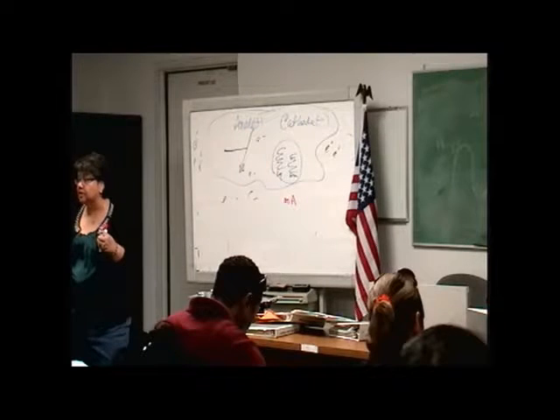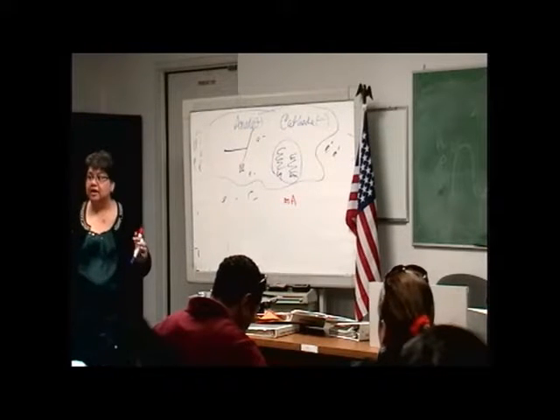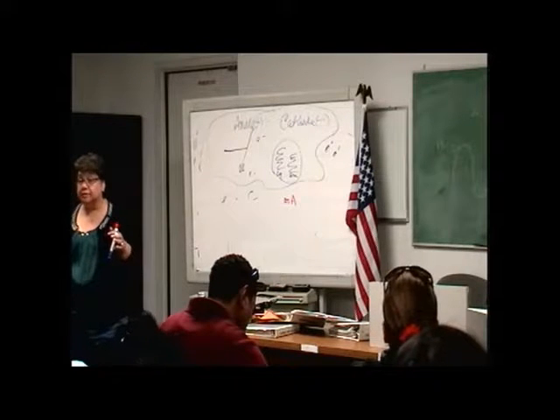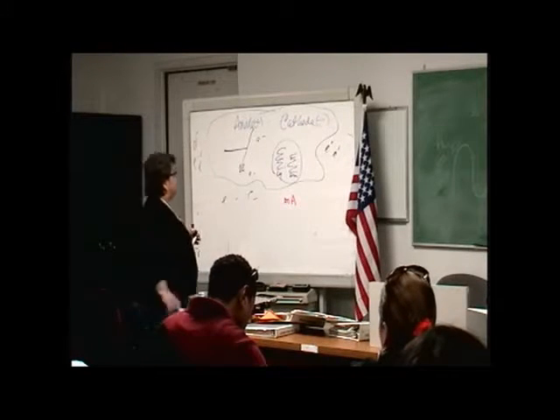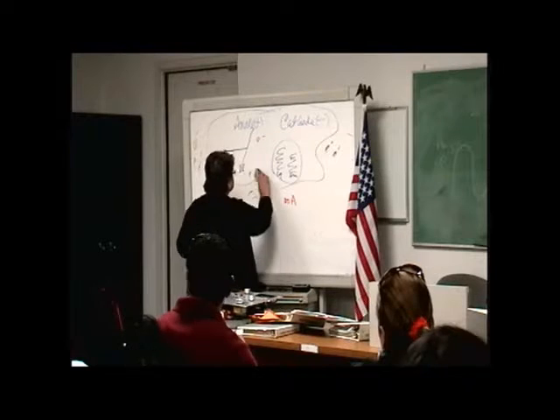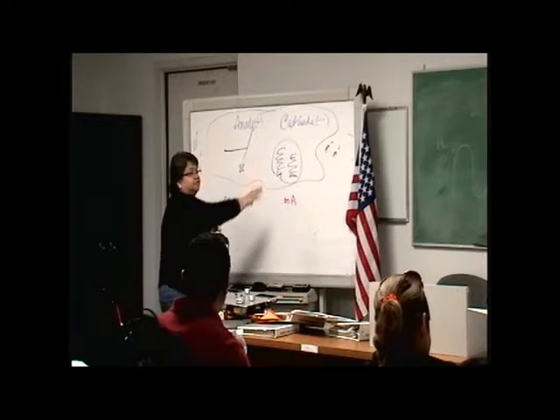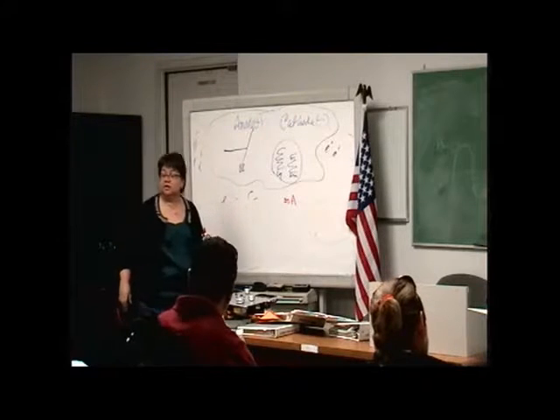We're being very selective. I only want so many electrons, and I want them as controlled as much as possible so I can get this X-ray produced. So we've made a vacuum glass that sucks out all the air so we can reduce all those free electrons there when we start making X-rays.